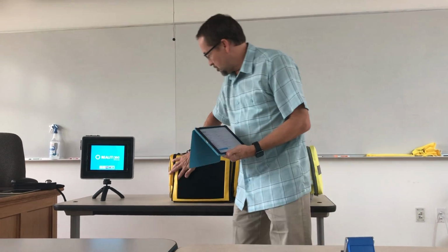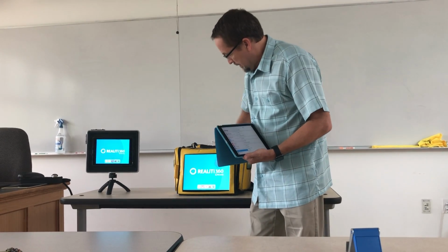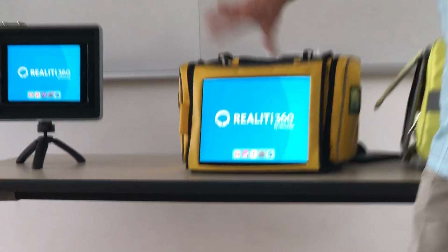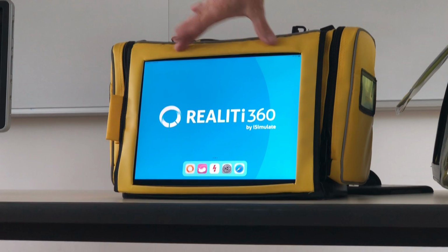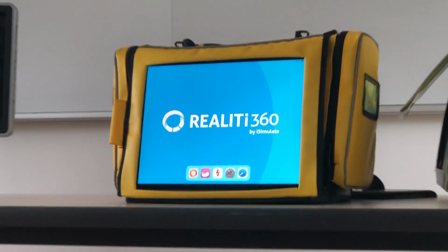So once you've made sure they're all looking at the same router, and I let this one turn off, you start the monitor first, and the monitor piece, the monitor iPad, is the heart of the system. It's an iPad Pro, because you have to have an iPad Pro to handle the complexity of the software. That's where the licensed software sits. You can actually add the other software for the camera or this to any iPad, and it's free.